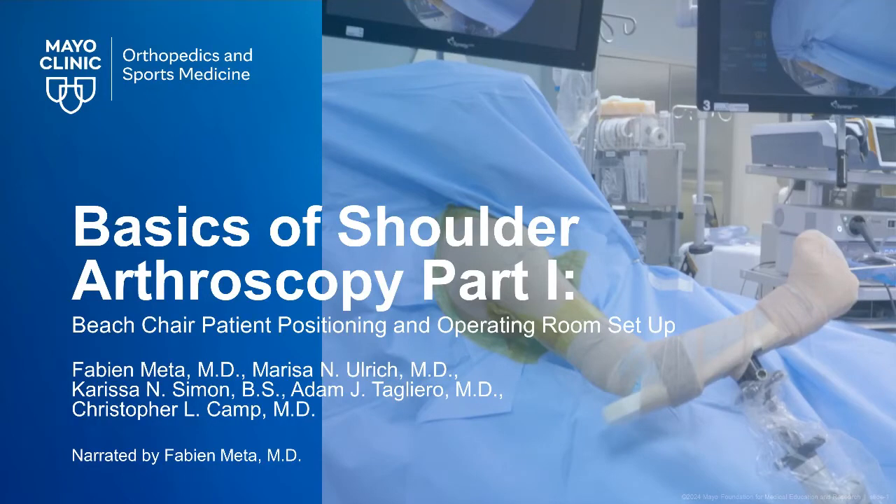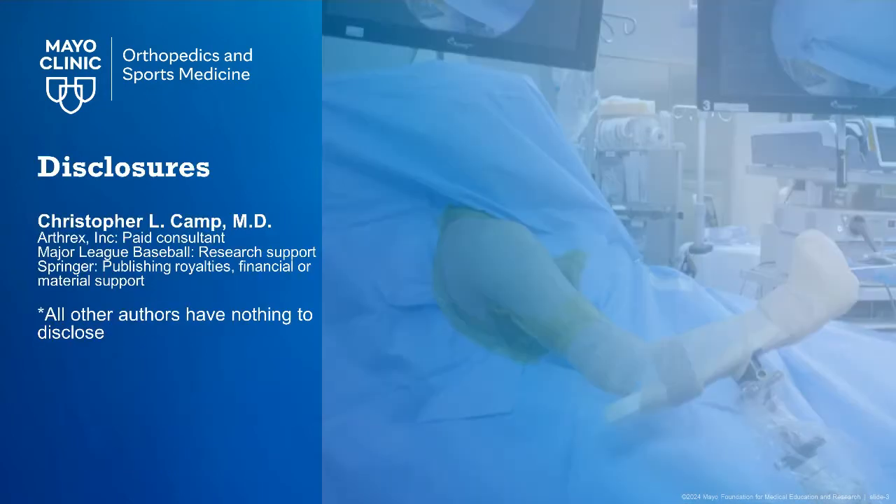This video will demonstrate a safe and reproducible method to position patients in the beach chair position for shoulder arthroscopy. Our disclosures can be found here.